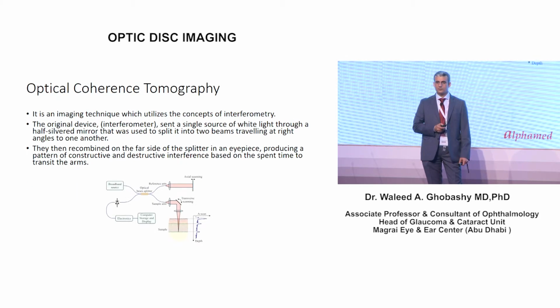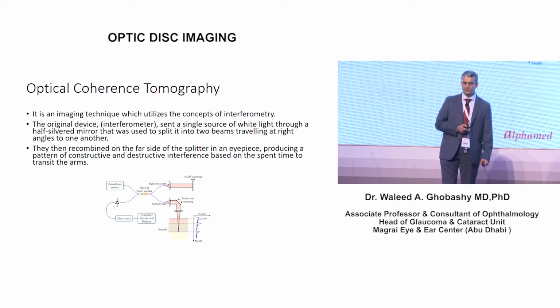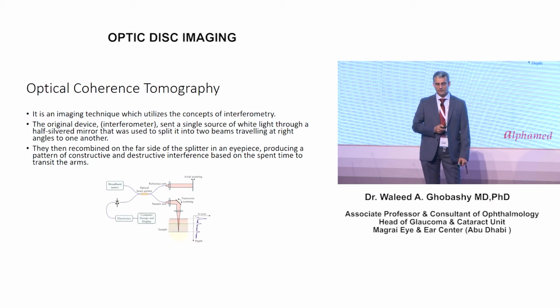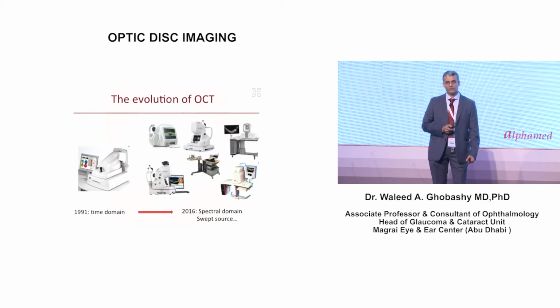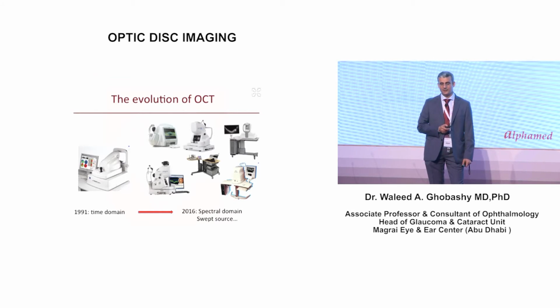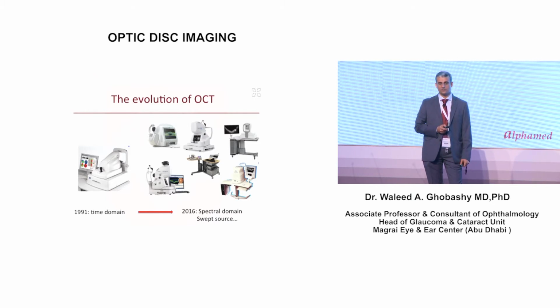Finally, optical coherence tomography, which is widely used by a lot of us. Its imaging techniques started mainly for engineering purposes and are now used widely in biological and health issues. It has had a lot of evolution: we started with the time domain in the 90s of the last century, and now we have reached swept source OCT. But most of our systems now utilize the spectral domain.